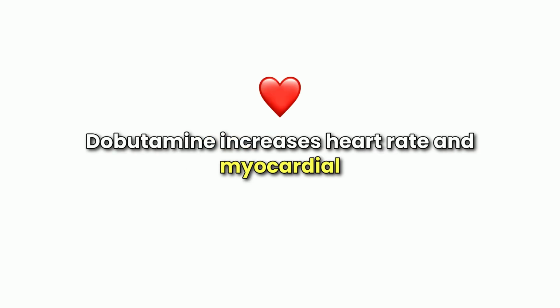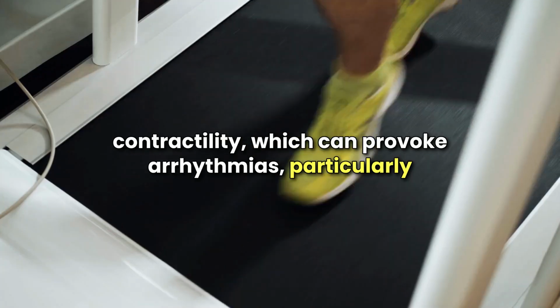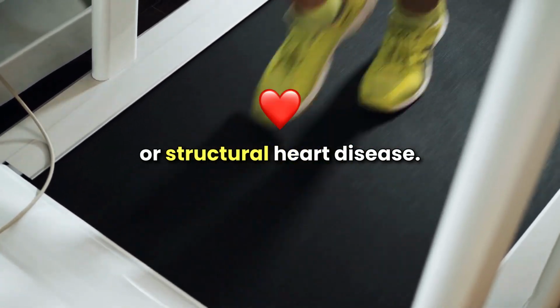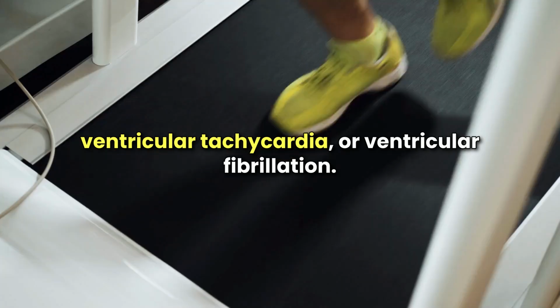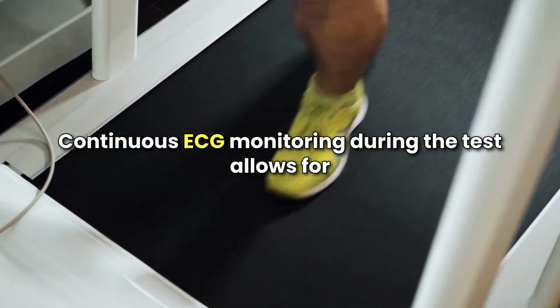Arrhythmias are a potential complication. Dobutamine increases heart rate and myocardial contractility, which can provoke arrhythmias, particularly in patients with pre-existing electrical abnormalities or structural heart disease. These can range from benign premature atrial or ventricular contractions to more serious arrhythmias such as atrial fibrillation, ventricular tachycardia, or ventricular fibrillation. Continuous ECG monitoring during the test allows for the early detection and management of arrhythmias. The test can be stopped if significant arrhythmias develop.